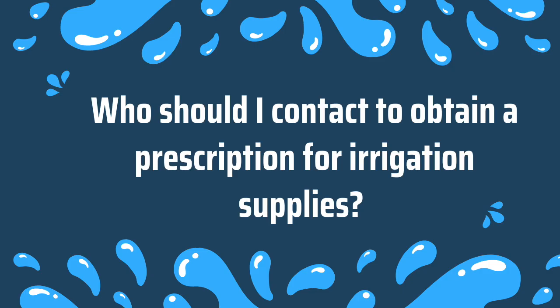and prescription requirements. And who should I contact to obtain a prescription for colostomy irrigation supplies? Well, you would want to reach out and contact your colorectal doctor or the surgeon that performs your procedure.